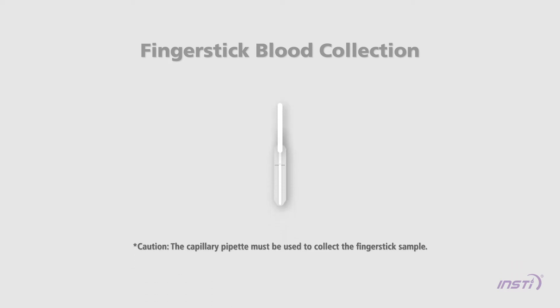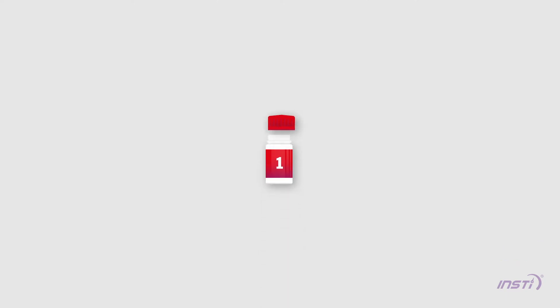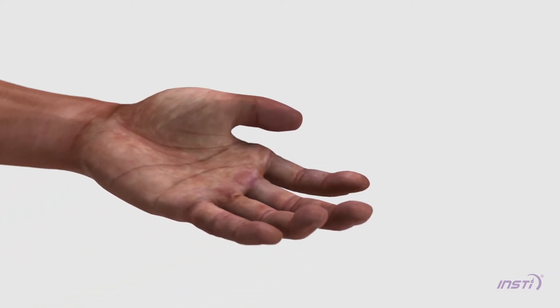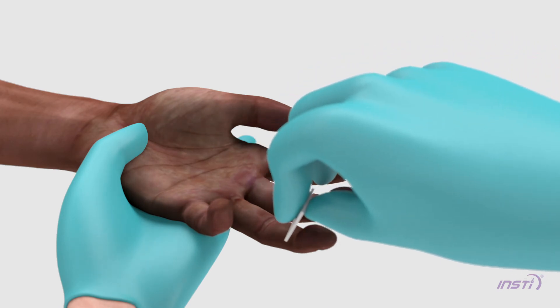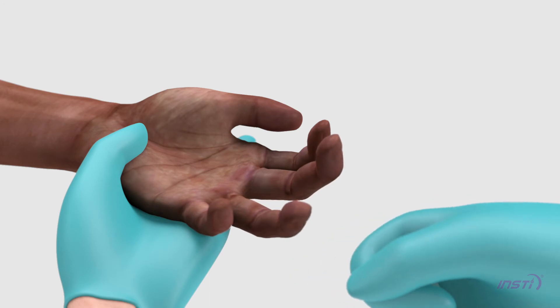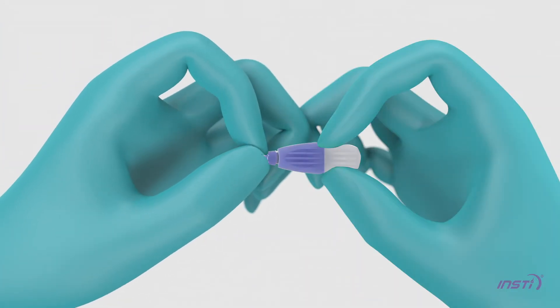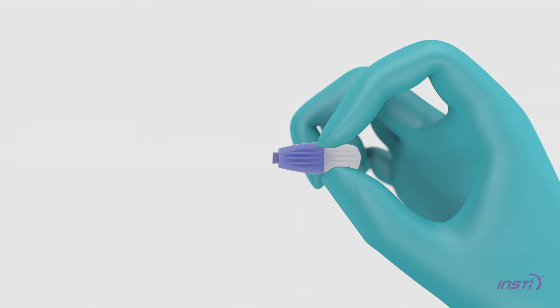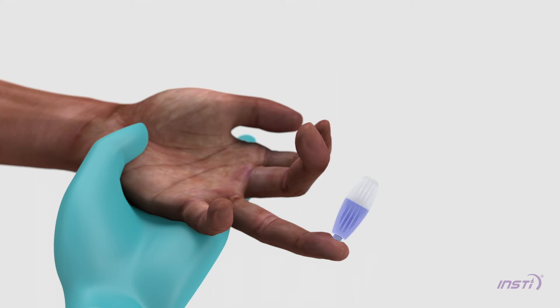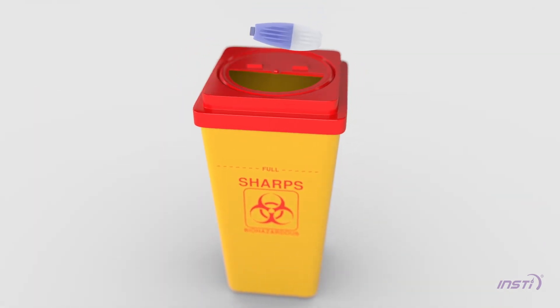Collect the finger stick sample using the capillary pipette. Open Bottle 1 and place the bottle on a flat surface with care. Place the cap nearby to recap the bottle after you add the blood. Position the patient's hand comfortably, at waist level or lower. Wipe the fingertip with an alcohol swab and allow the finger to dry thoroughly. Massage the patient's finger in one motion towards the tip. As soon as the finger is dry, twist and pull the blue tip out of the lancet and place the tip aside. Place the lancet on the side of the fingertip and press hard until you hear a click. Immediately dispose of the used lancet into a proper sharps container.